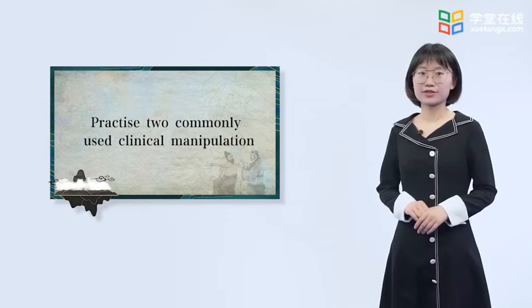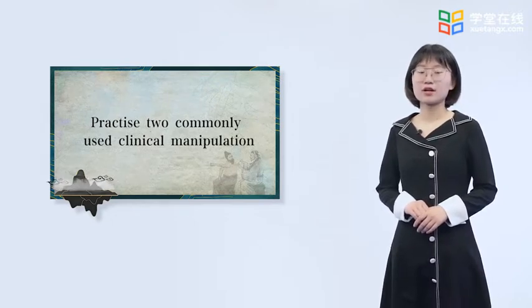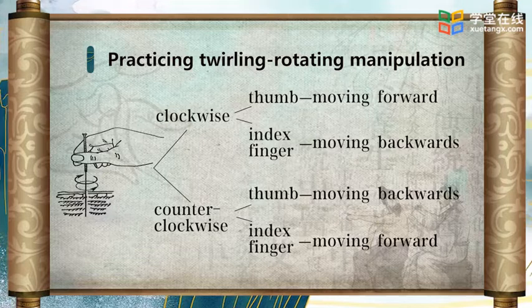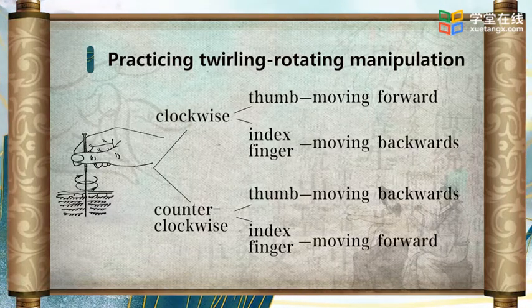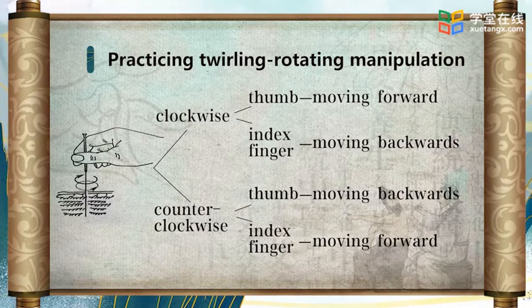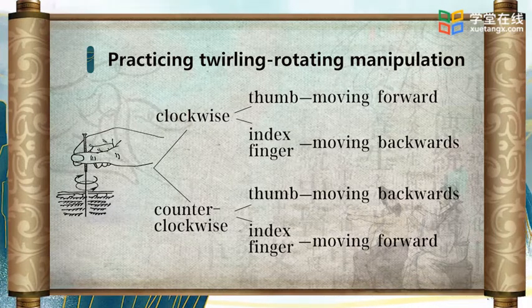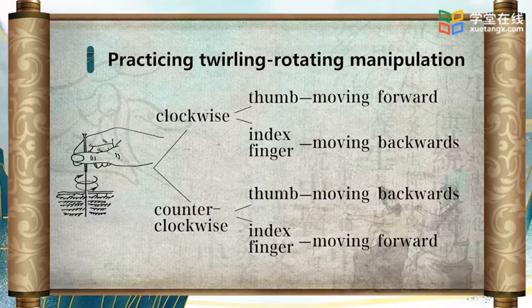After we have acquired the insertion of the needle, next we may start to practice two commonly used clinical manipulations. When the needle is inserted, use the thumb and index finger to hold the handle and twist it on the original spot clockwise, with the thumb moving forward and the index finger moving backwards. And then counterclockwise, with the thumb moving backwards and the index finger moving forward.